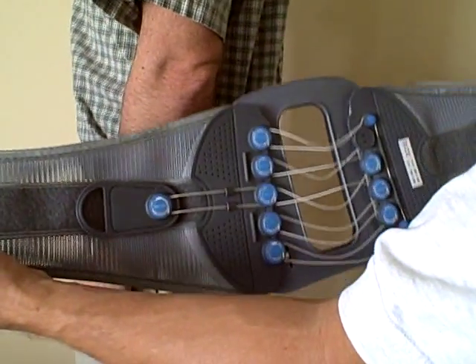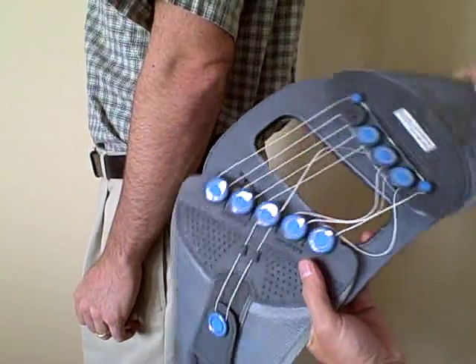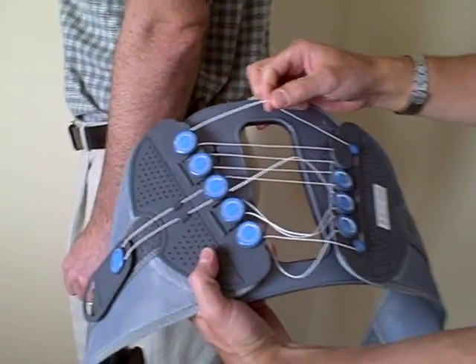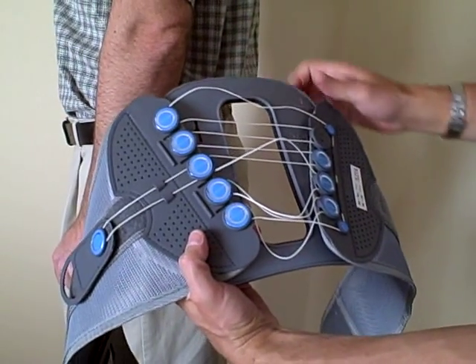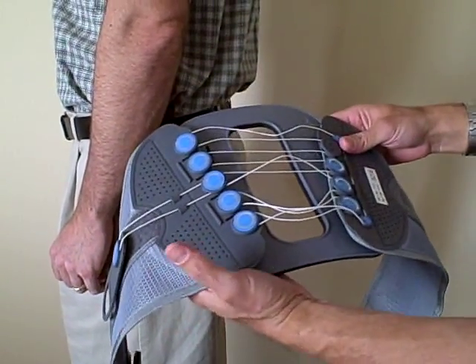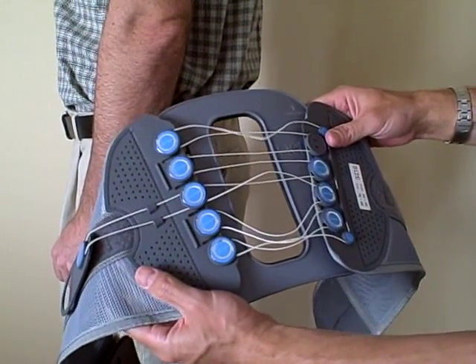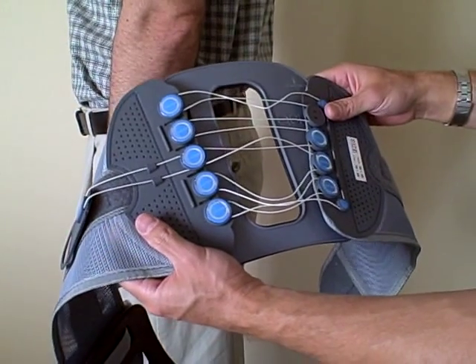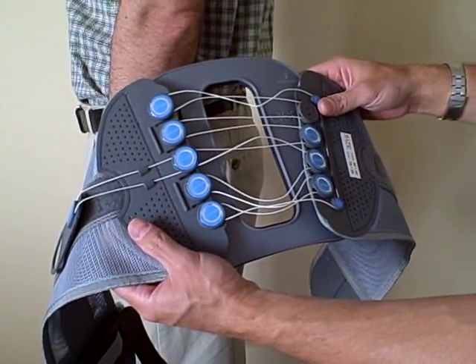It's hand washable in warm water. The cord is triple woven nylon, similar to parachute cords, so it's not going to break under pressure. It's a very high-quality back brace, warranted by the manufacturer Cybertech for five years, and it's available at www.dme-direct.com.